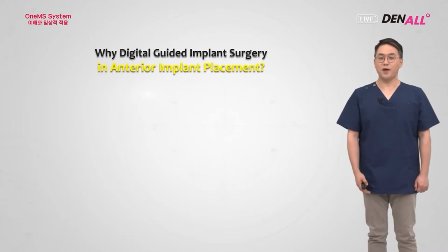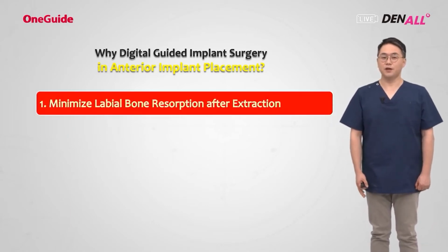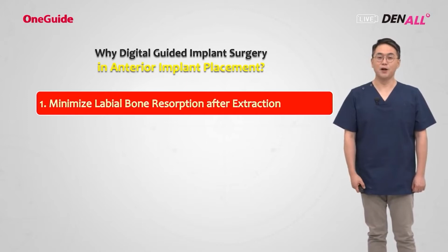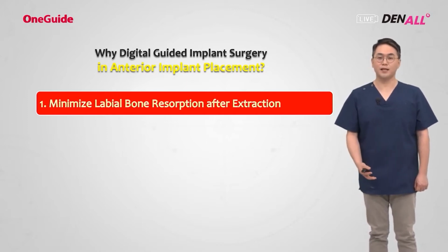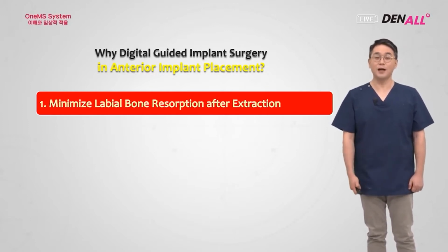Then, why in the anterior part do you need to use a digital guided implant surgery system? There are 3 reasons. First, after extraction, inevitably there is bone resorption, but with this system, such resorption can be minimized. The thin labial bone will be resorbed after extraction, so you have to carefully take the tooth out. The recommendation, because of that, is also to go flapless.